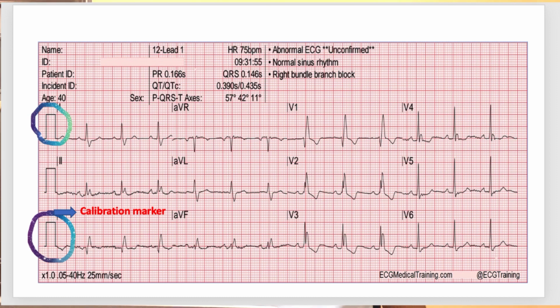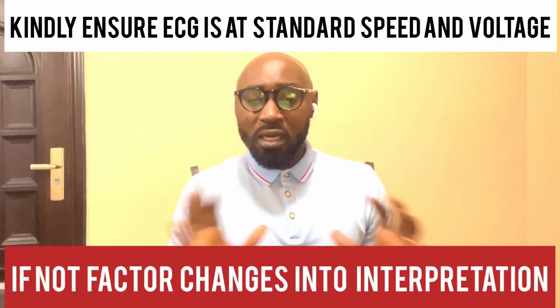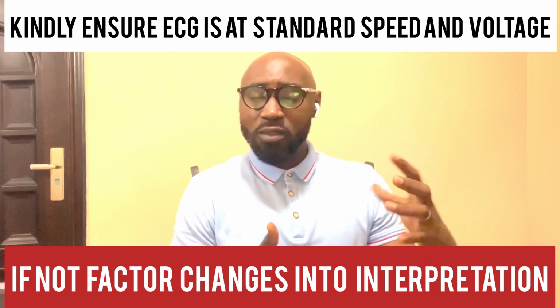Having discussed the relevance of all this information, it's important to ensure that the ECG is interpreted at standardized rates or speed and a standardized voltage.